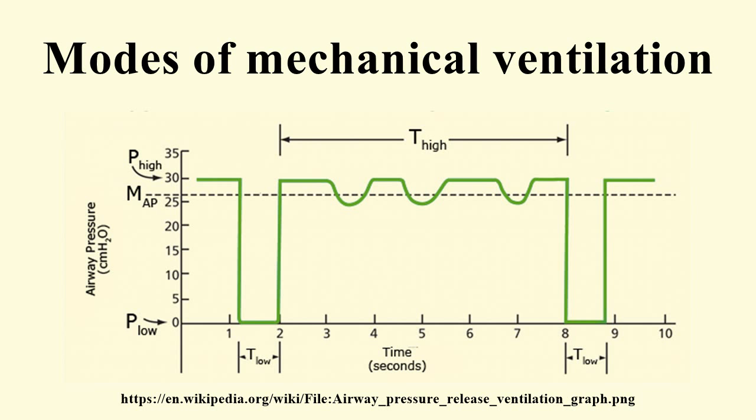There have been substantial changes in the nomenclature of mechanical ventilation over the years, but more recently it has become standardized by many respirology and pulmonology groups. Writing a mode is most proper in all capital letters with a dash between the cycle and the strategy. A taxonomy for mechanical ventilation. The taxonomy is a logical classification system based on 10 maxims. A ventilator design: 10 maxims.